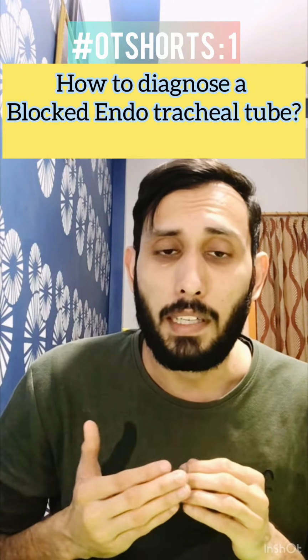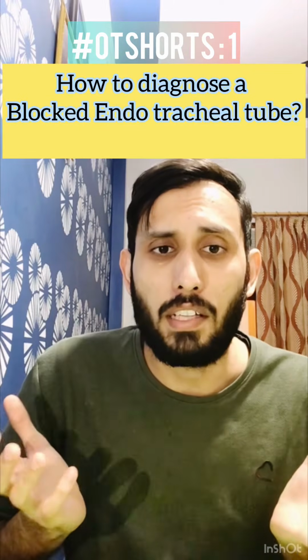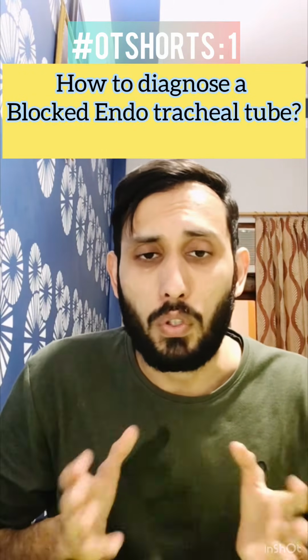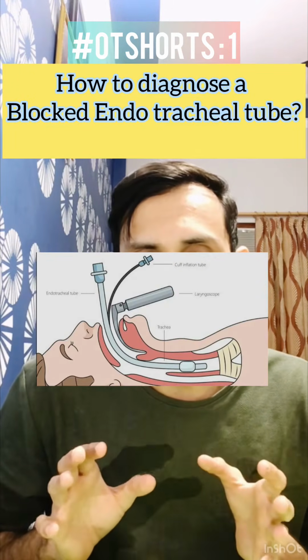But if the tube is completely blocked, you attach the ambu bag and you are not able to press at all. There is no air entry, or the saturation has already started dipping down. You don't have time. At that time, you have to do the laryngoscopy and replace the tube as such.